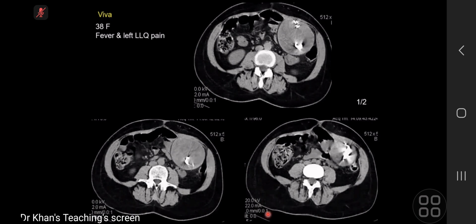Okay, so it seems like, depending on what the surgery was for primarily, it could be either a tumor recurrence within the area of surgery, given the surgical clips. Or this could be a seroma which has higher attenuation because of secondary infection. Given its presence in the mesentery, this could be something like a desmoid tumor or a peritoneal deposit. Okay.